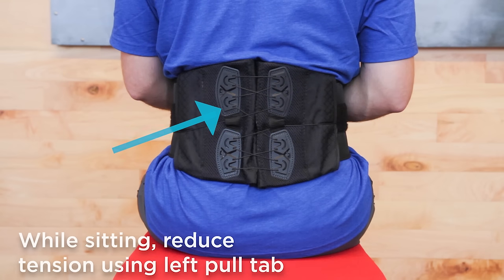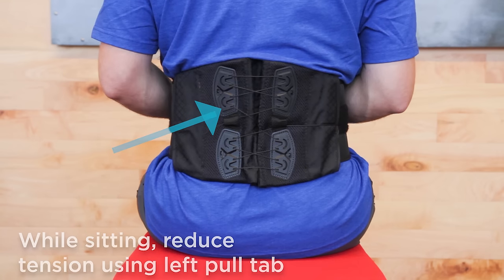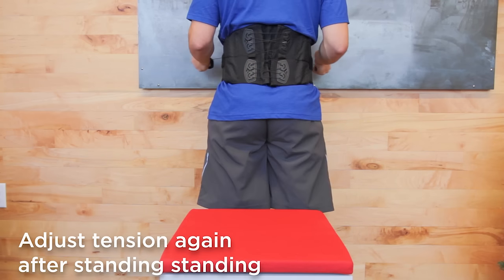For comfort while sitting, use the left pull tab to lessen tension on the upper portion of the back panel. Reapply tension once you stand up.